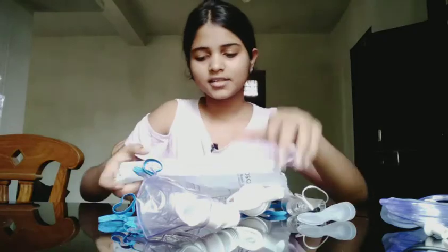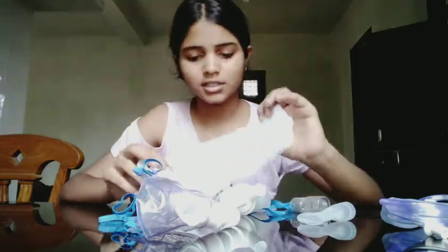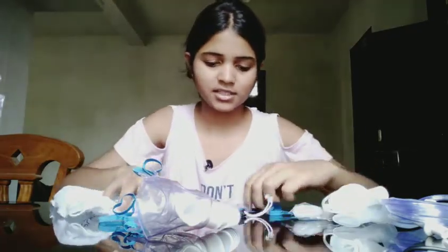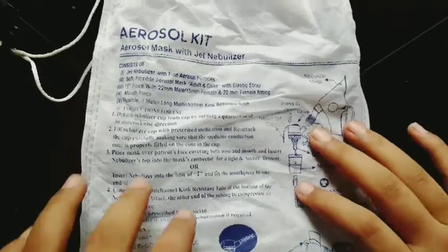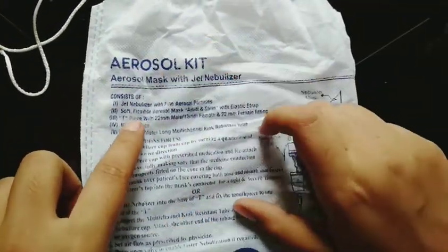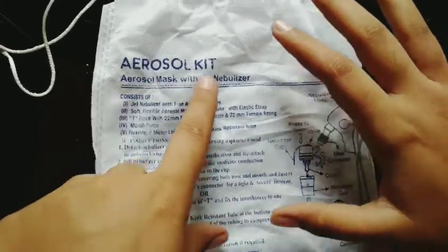We get a lot of connecting accessories inside. There are also instructions listing what's included in the pouch. If something is missing, there is a warranty so you can return it and get it replaced. This pouch is an aerosol kit — there is an aerosol mask with a jet nebulizer.